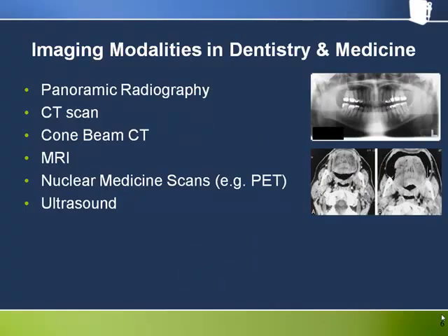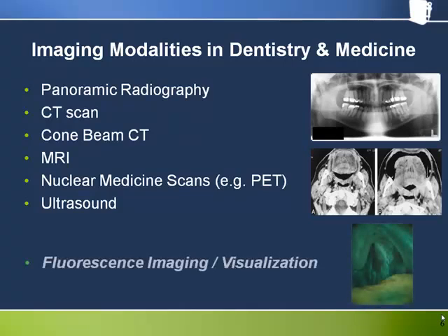Let's talk a little bit about how we should view this technique of fluorescence visualization. This slide is based on one that I saw from a presentation at an oral surgery meeting on different imaging modalities used to provide information on pathology in the head and neck region. It struck me at the time that this was a good way to introduce the concept of fluorescence visualization. Just like a lot of these other imaging techniques, panoramic radiography, CT, cone beam CT, MRI, PET, ultrasound, fluorescence visualization is not a standalone diagnostic test. It is another item in the arsenal of tools clinicians have to help them assess the health of human tissues.